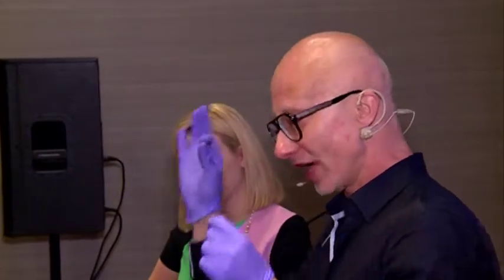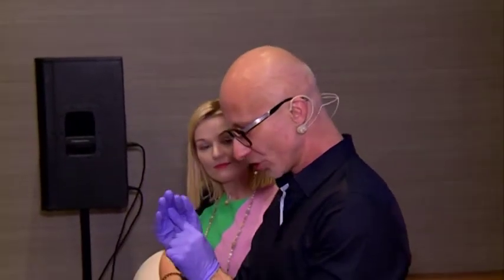Sometimes, if not, it goes down. But sometimes you can use the cannula between the two fascias. You can use it, but this is more tricky. Whenever I go in with the needle, I determine my insertion, and then I have no resistance. Whenever I go over the resistance, I penetrate the cannula. So this needs much more power.